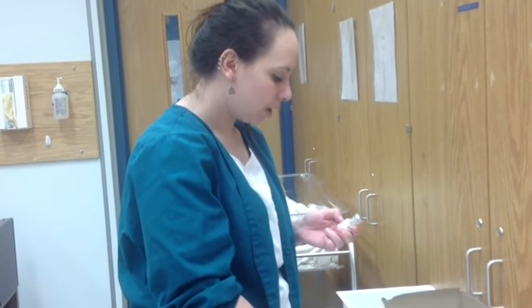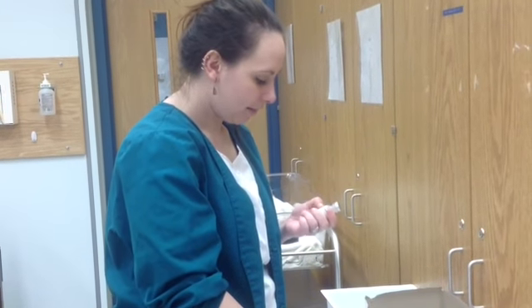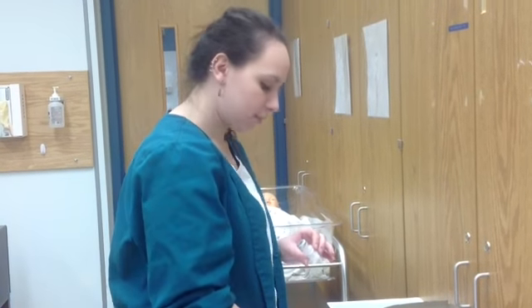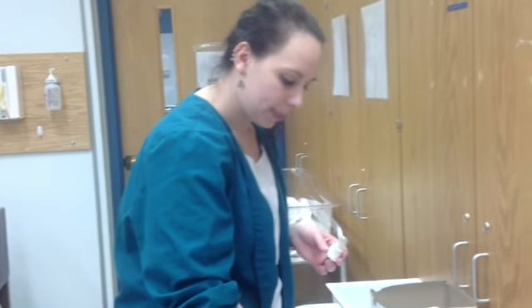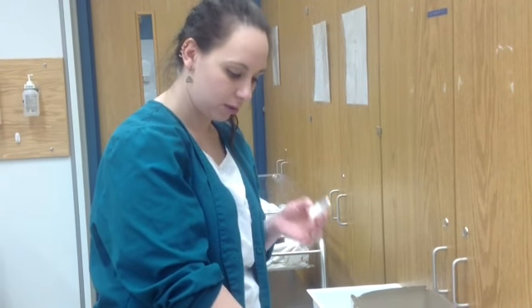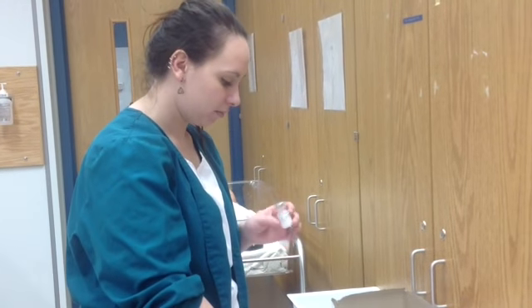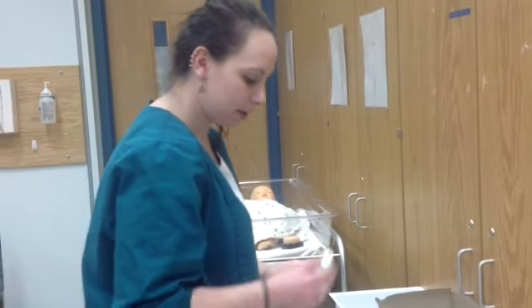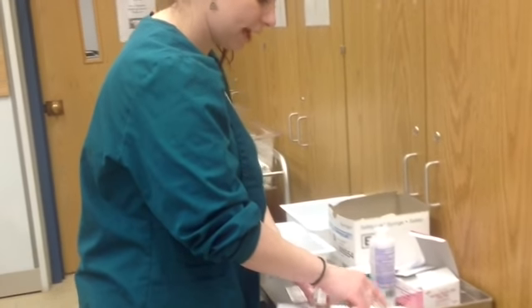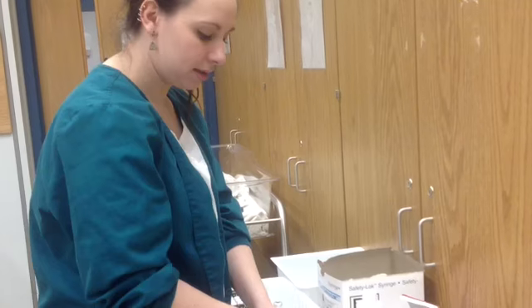This one comes in 2 million units per mL. So I'm going to convert that, which I did ahead of time with a partner, which comes to 1.2 milliliters I'll need to draw up. So I then want to make sure that's for the right route. This is an IM injection medication, so I can use this bottle. Everything seems good. So I'm going to take it out, close the drawer, and then again verify which patient I have, why he needs this, the dosages, make sure my calculations are correct.